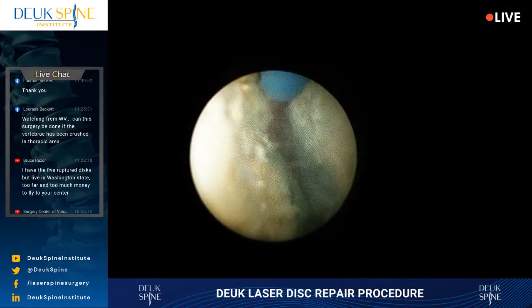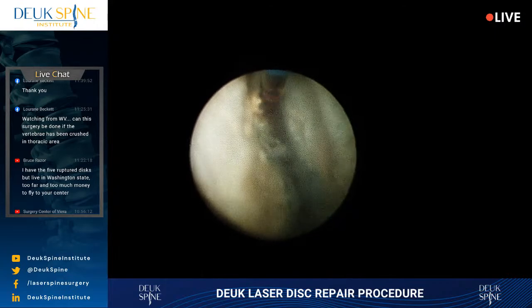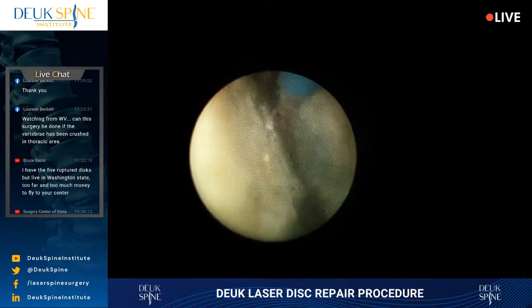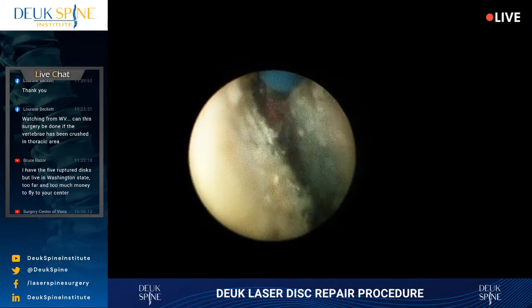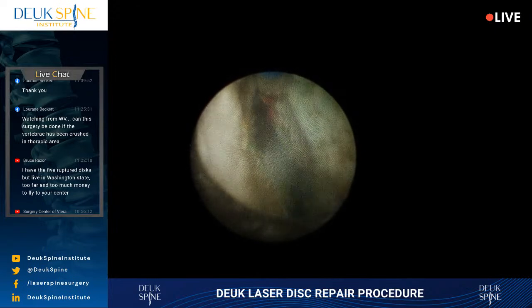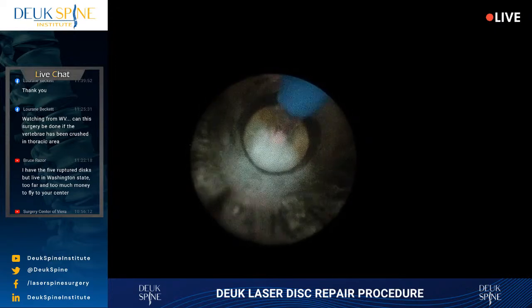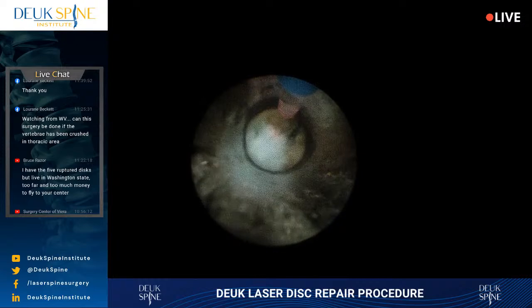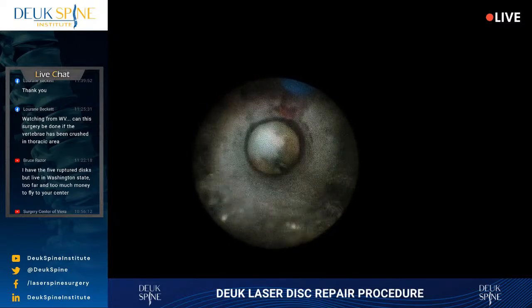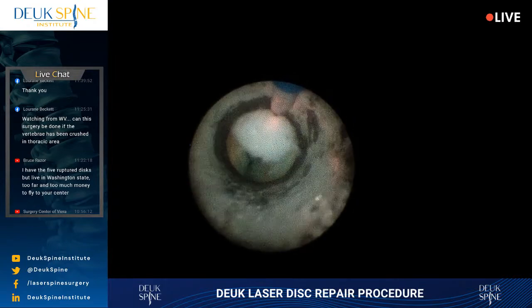One thing about the laser that I use, that if you're going to do this surgery, you must use this laser, Holmium YAG. There's nothing I do that's happenstance or chance. This laser is special. It actually does more than annihilate the bad tissue and destroy it by vaporization. It actually does something else very important. Anybody know what that is?